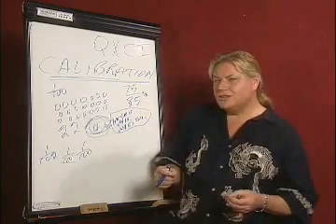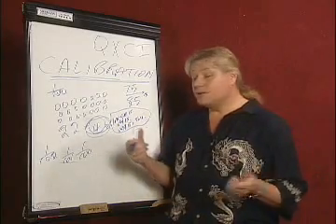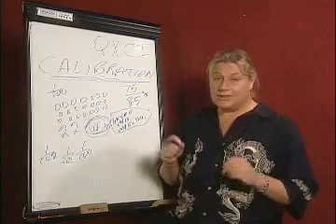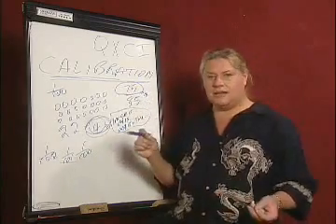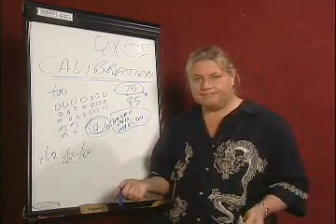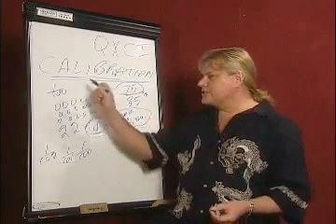If we tried to increase our accuracy with every patient, we're going to find that we just can't quite get beyond that. Sometimes we'll get a 95, 99%, but that can't be done with every patient. If we did, we're going to lose too many of them. Whereas now, when we have the 75% cutoff, we're going to find that we only lose maybe 1 patient in 50. Meaning we can work in a day-to-day practice with our patients. So this is how the system calibrates.